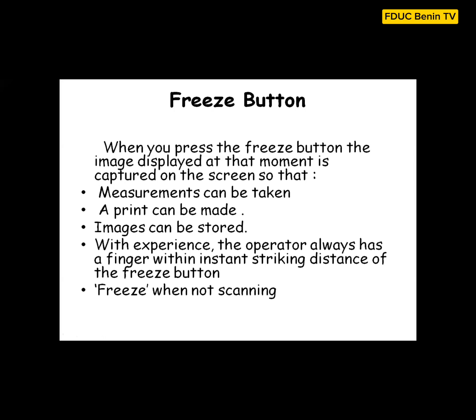As you scan, one hand is on the probe, and the other hand is using all the other knobs, the gain, the depth, the freeze. Most people, when they start scanning, want to make sure their hand is so close to the freeze button, at striking distance, so that the minute they see something, they just freeze, boom.